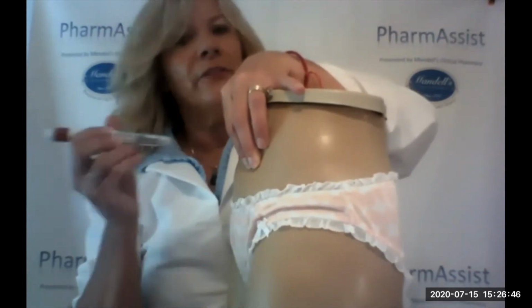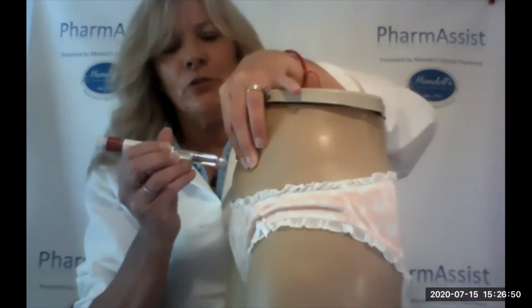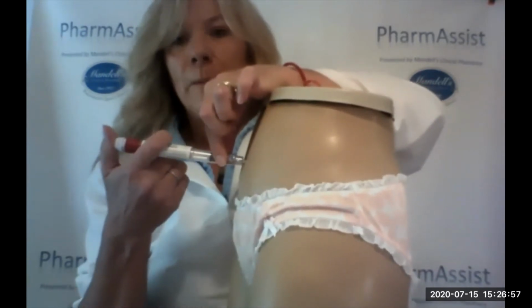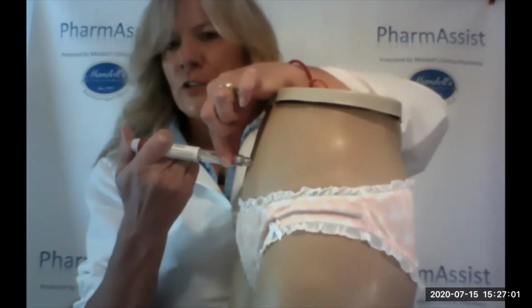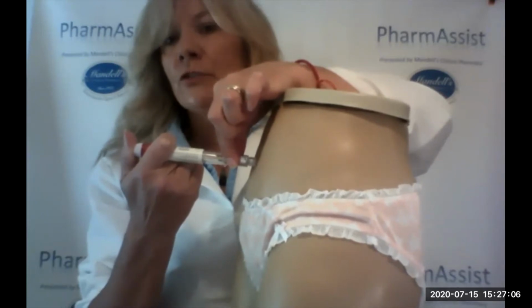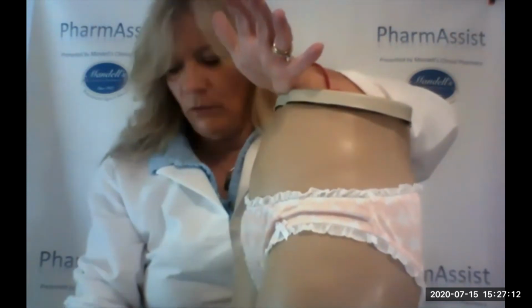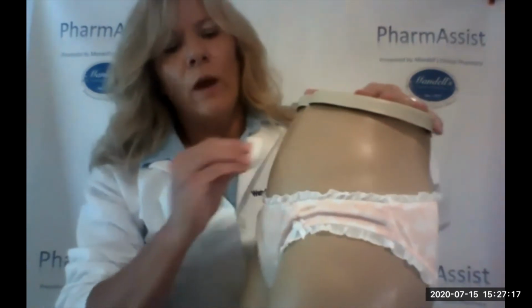Again, we do not have to jab this needle. Just place it to the skin, give a little push. That needle goes all the way in. Once that needle's in, then you are going to push on the end of this pen and push all the way until you feel almost the pressure that you can't push anymore. And once you feel that, count to 1, 2, 3 and let go. Then remove the needle in the same angle that it went in, set it down, and put a little cotton ball to that area. Wipe it if you need to.